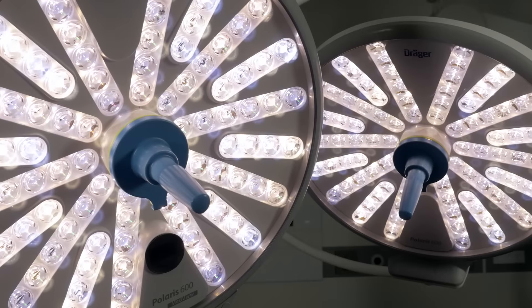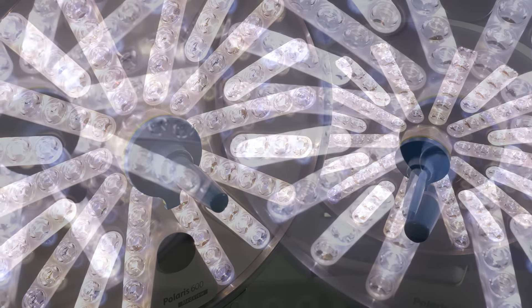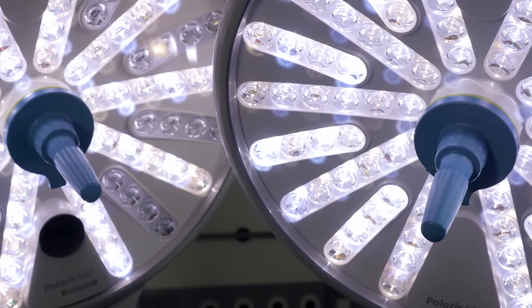Welcome to this Draeger tutorial. Today we are introducing our new Polaris 600 surgical light and familiarizing you with its functions.